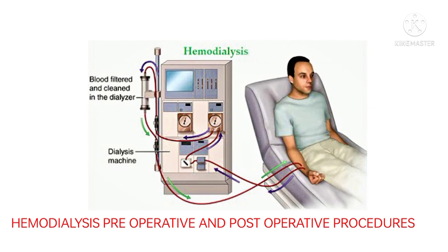Central venous catheters for hemodialysis are large-bore, double-lumen catheters that are inserted percutaneously into the jugular, femoral, or subclavian vein. They are used when immediate access to the bloodstream is needed. These access sites can be easily placed at the bedside and used immediately after placement is confirmed by X-ray.